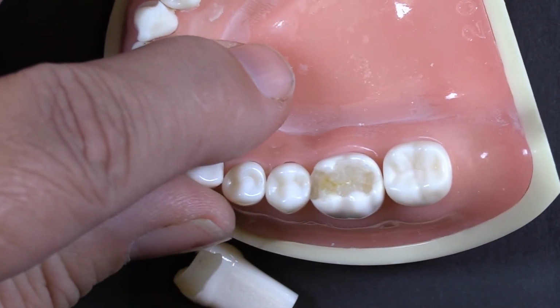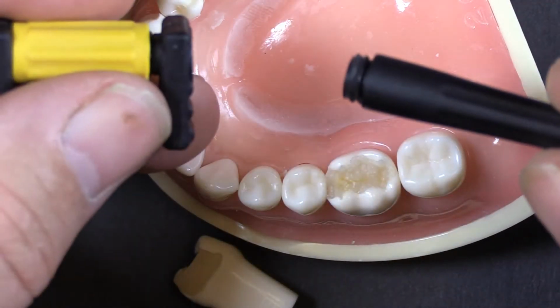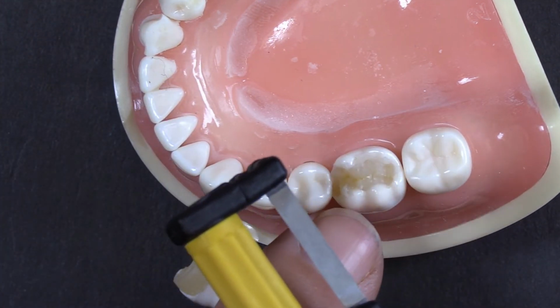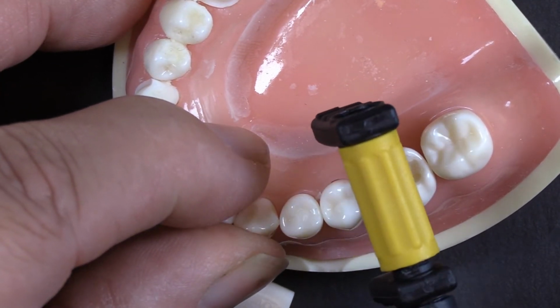and I don't know if that's really much of a contact on that one. But I'm going to flip the handle around. You saw I could just take this handle off. Flip it around to the other side so that the abrasive side is towards the restoration. Have it taut. You can bring it down.